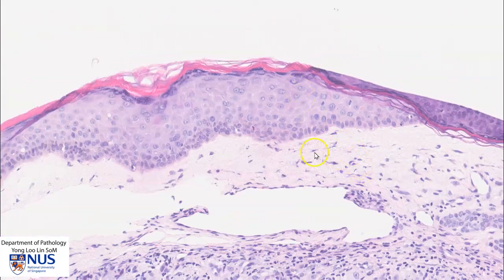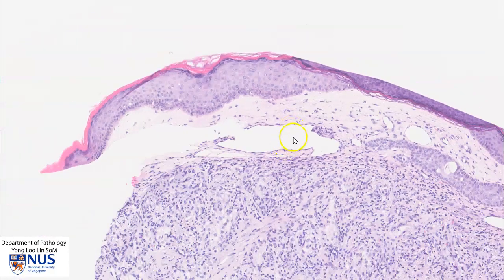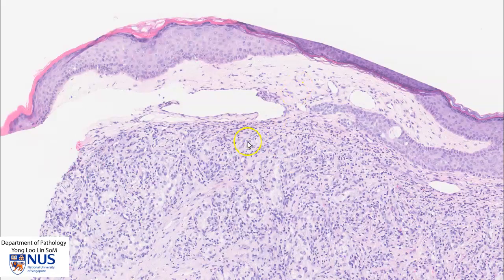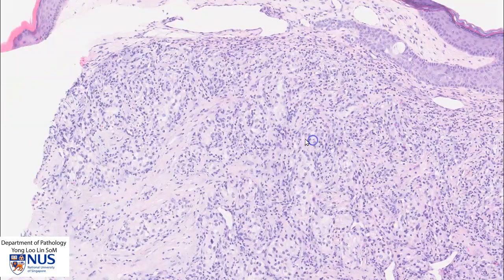Deep to this is the dermis, which is usually composed of collagen as well as blood vessels, and the dermis is usually relatively hypocellular. As we move deeper, we can see that this whole area appears much more cellular, and this is abnormal.